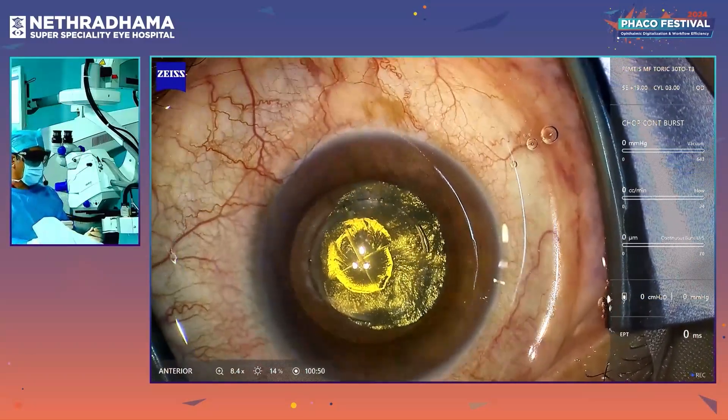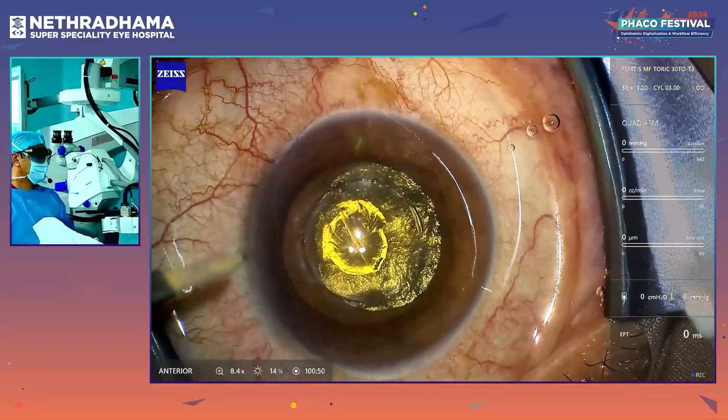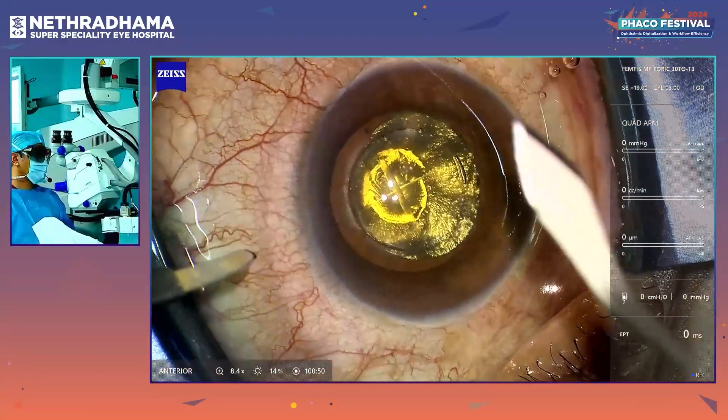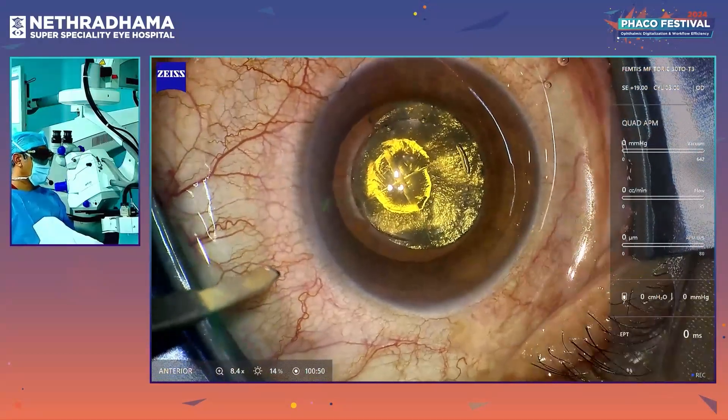This is a 57-year-old female with a grade 2 softer cataract. You can see that the capsulotomy and the nucleotomy 4-quadrant has been done with the Lens AR.